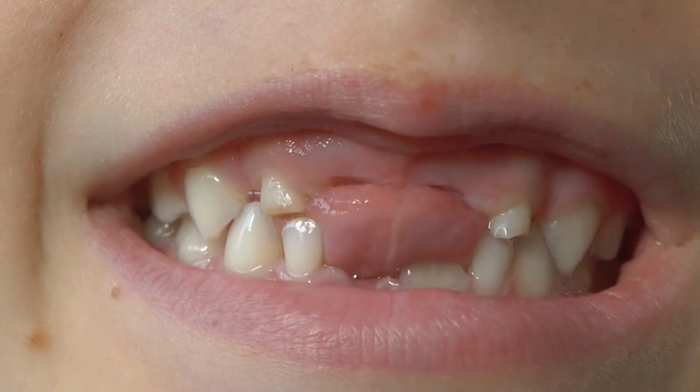So if you or someone you love has ill-fitting dentures and you can hear a lisp, if they have trouble pronouncing words and having crisp, plosive sounds, or there's a clacking or clicking when the teeth come together, those are signs that the teeth aren't custom made for them and they need a new set of dentures. Now I'd like to walk you through the process of going from having teeth, missing teeth, or failing teeth to having a well-fitting denture.